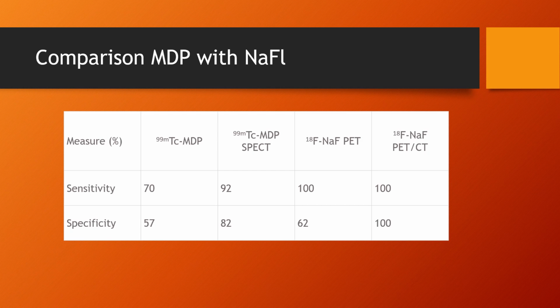We cannot tell if that is a metastatic lesion, if it is infection in the bone, if it's osteomyelitis, or if it is a fracture or arthritis. We can't really tell what it is. We can just tell something is there. Bone scans are always bad at that. We can tell what the changes are, but we can't specify.